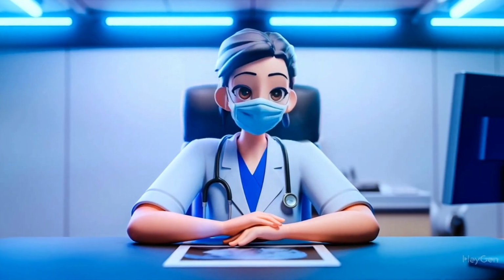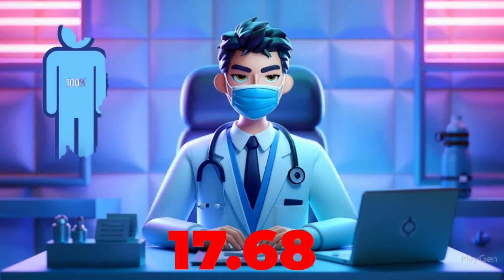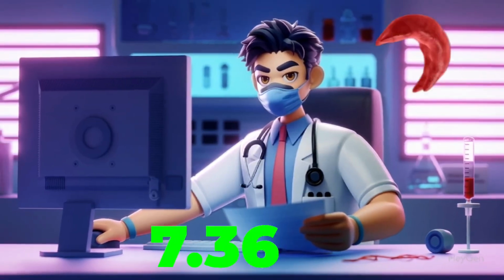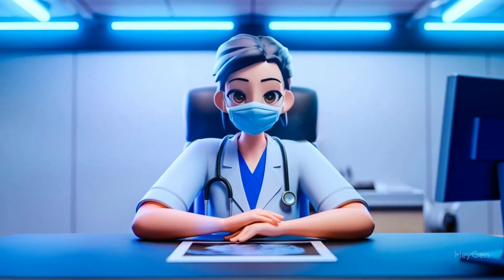Now let's learn the abnormal levels of hemoglobin. The high level of hemoglobin may indicate dehydration, smoking, or high altitudes. And low level of hemoglobin may suggest anemia or bleeding. So this was the hemoglobin in the CBC report.